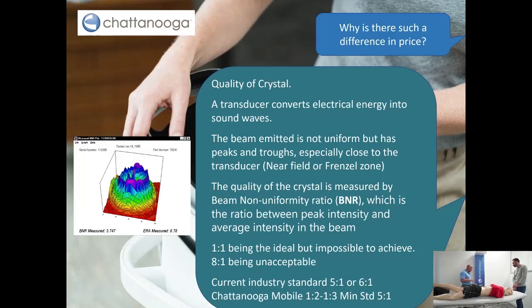I realised that what you're paying for is the crystal in here, the piezo crystal, and the quality of that crystal. Okay? Because it's this crystal that converts the electrical energy into these acoustic sound waves. Okay? But these sound waves are not emitted uniformly. They're going to have peaks and troughs, especially close to the transmitter.